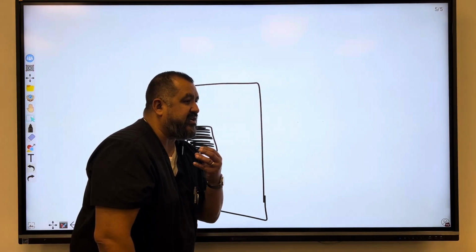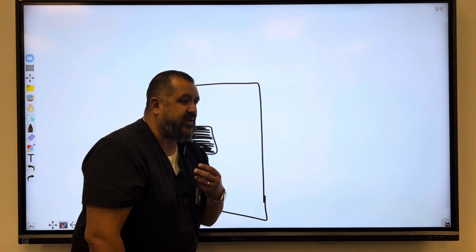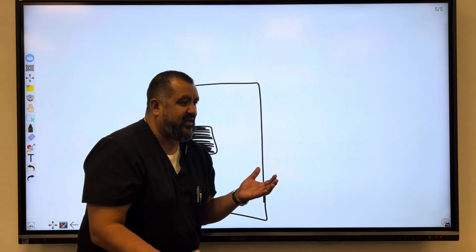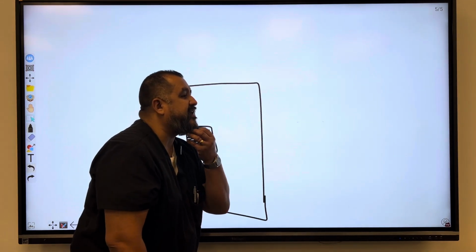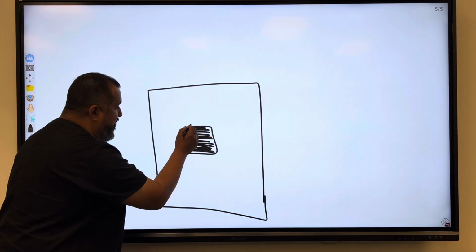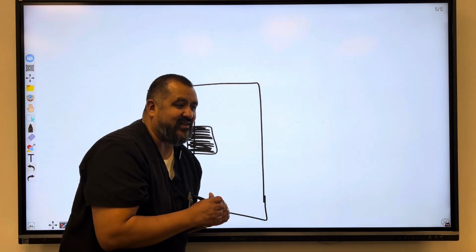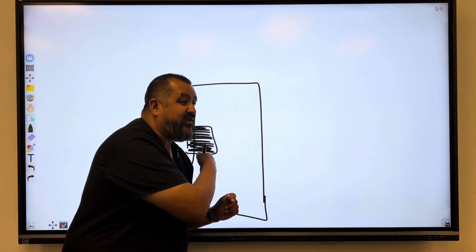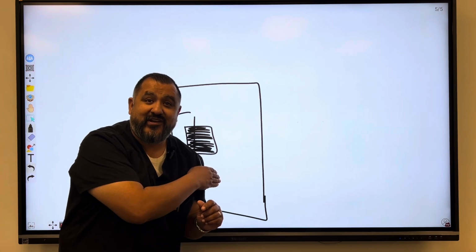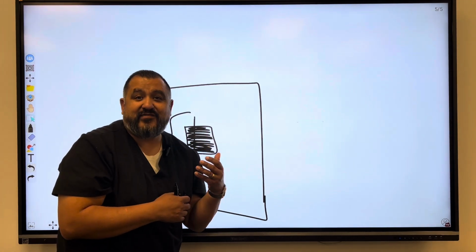And what happened was, you guys, the image was underexposed. And I was trying to explain to them over the phone, of course. Well, you know what? It looks like because your C spine was more over here, so the vertebrae were more back here. So guess what? The x-rays went right through and hit the chamber a lot quicker. So the response time said, hey, I'm done. And it cut off the exposure.